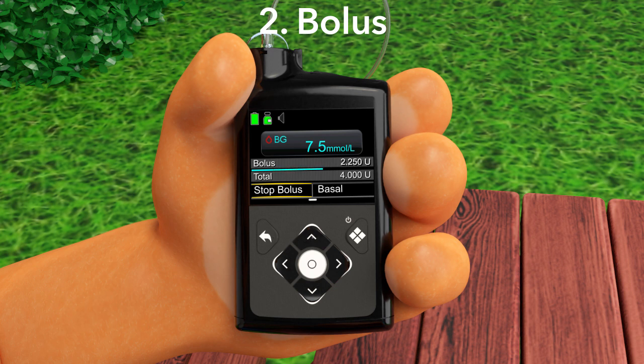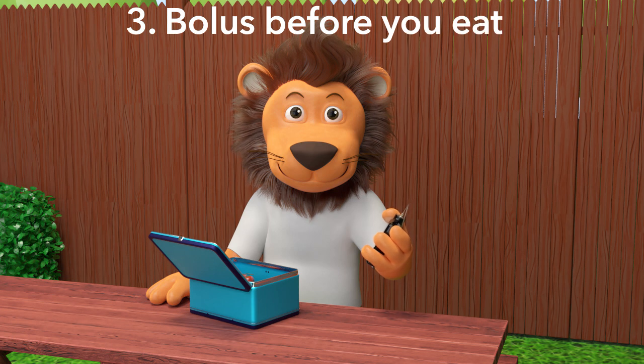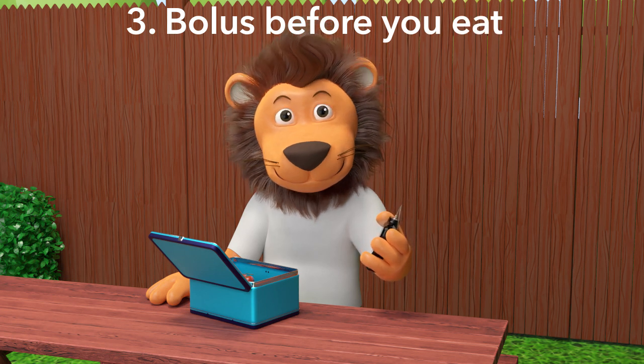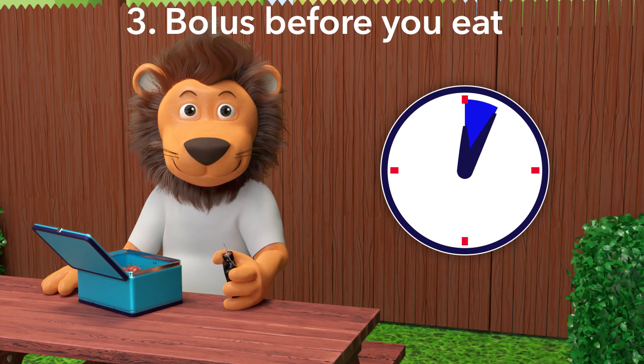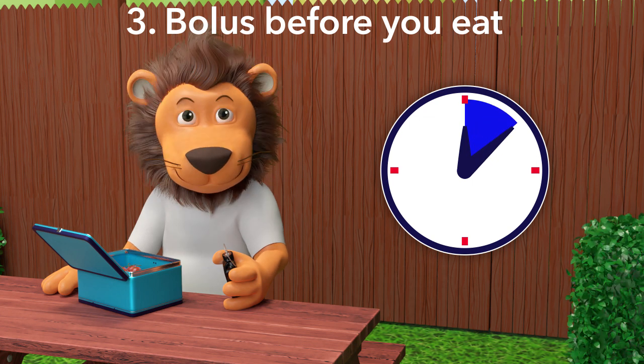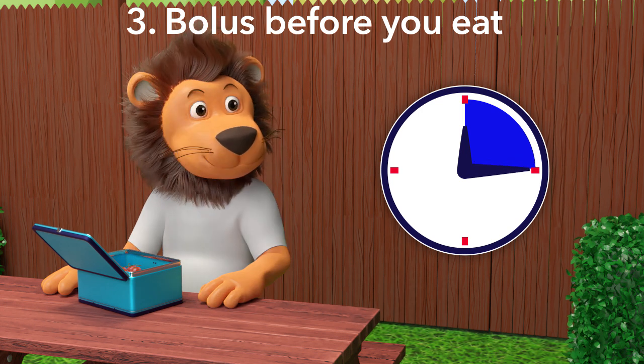You can tell the pump is delivering the bolus as the blue line moves across the screen. The third and final step we need to remember is that whenever you or your parents give you a bolus for carbs you are going to eat, you should always bolus before you eat, not after or during. In fact, you should bolus 10 to 20 minutes before you eat, so that there is enough time for your bolus insulin to work in your body.